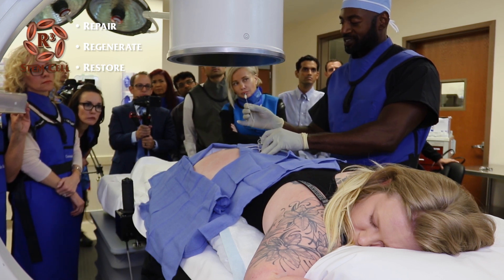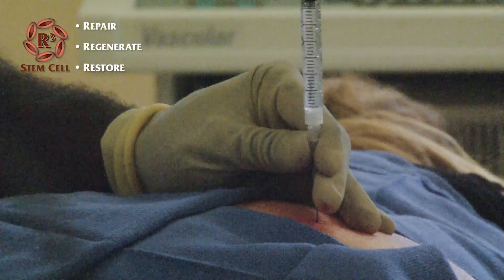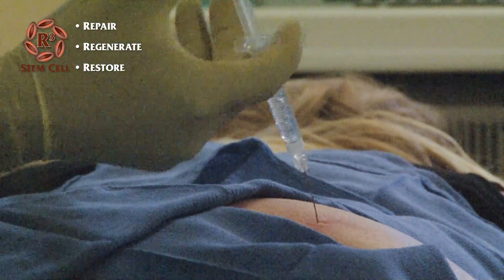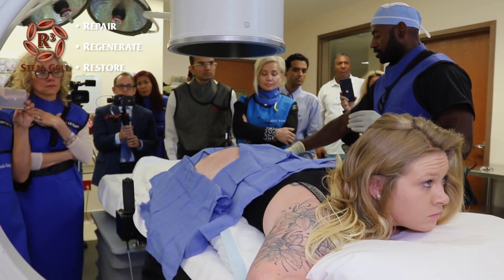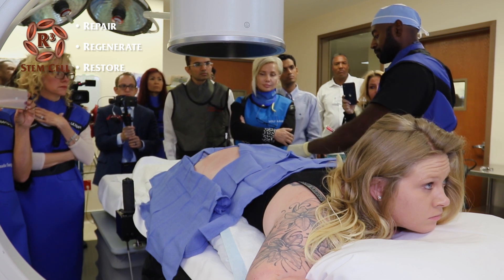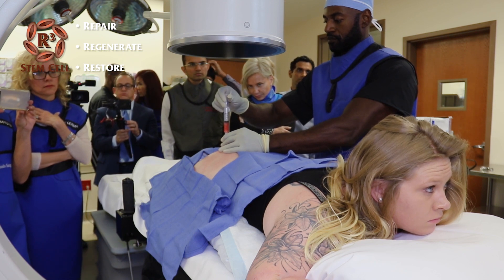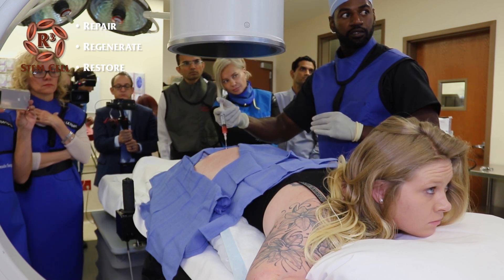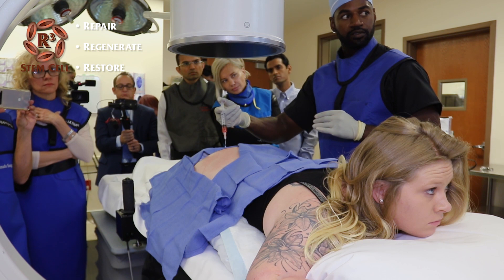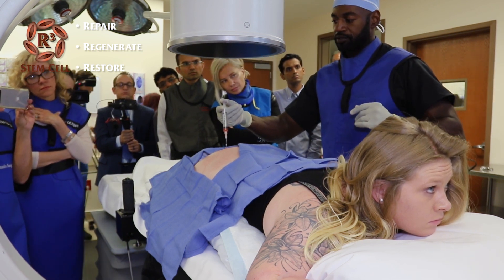Let's watch the contrast. See the contrast — this is going all over the joint. We kind of want to have this spread throughout the joint space.